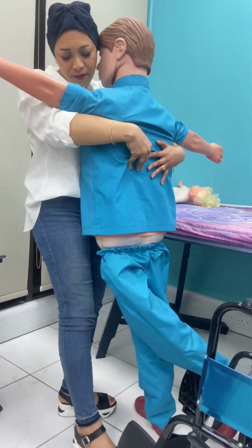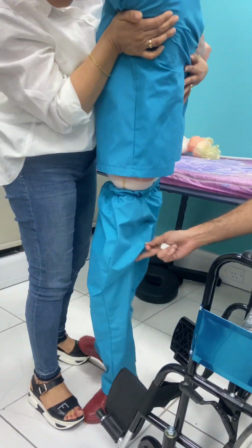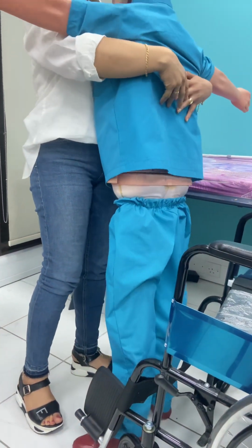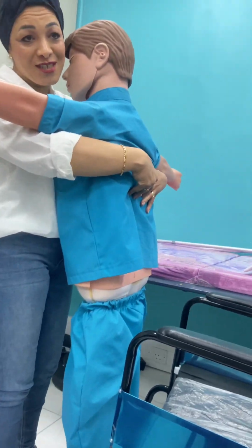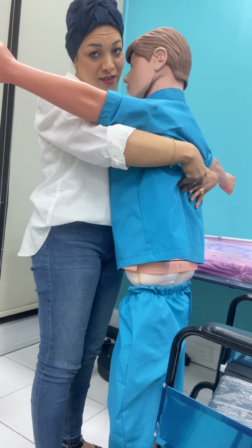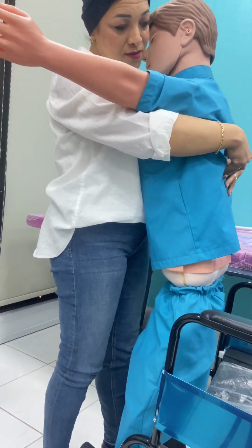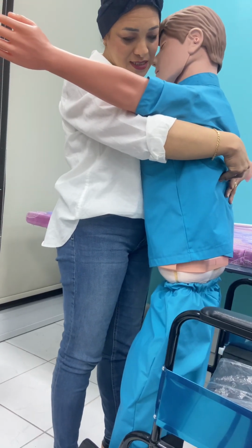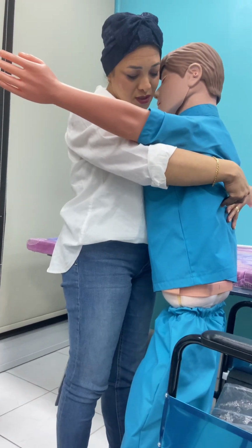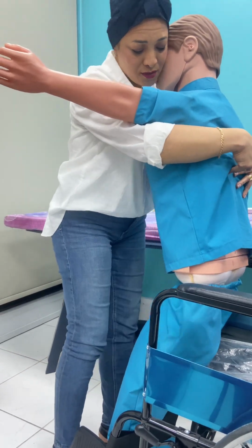This is one step only. Can you feel the chair behind you? He said no. So we can go back. Yes. Can you feel it now? Yes. So now at the count of 3, you're going to sit. 1, 2, 3.